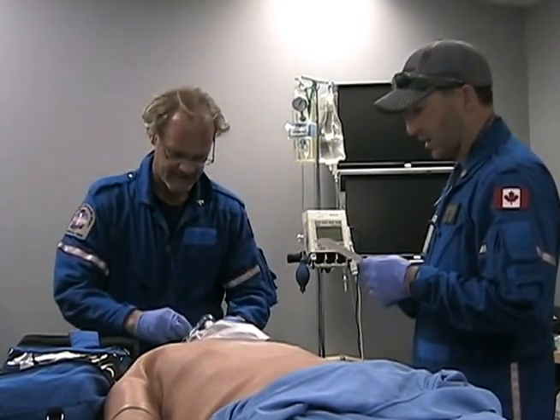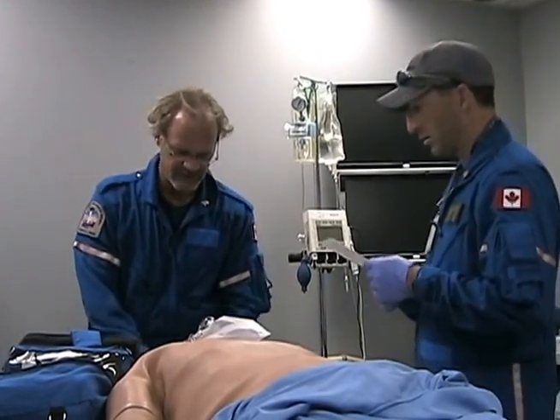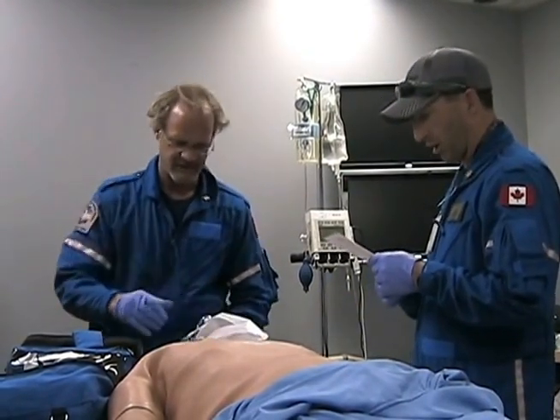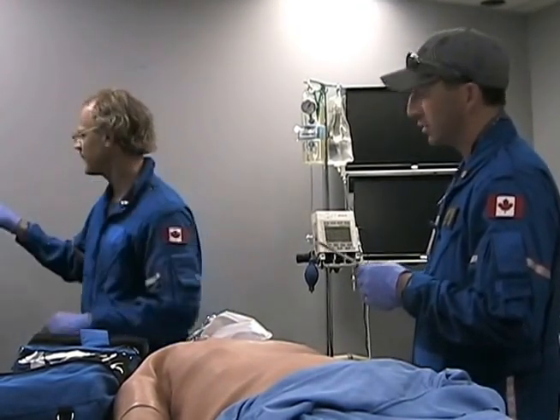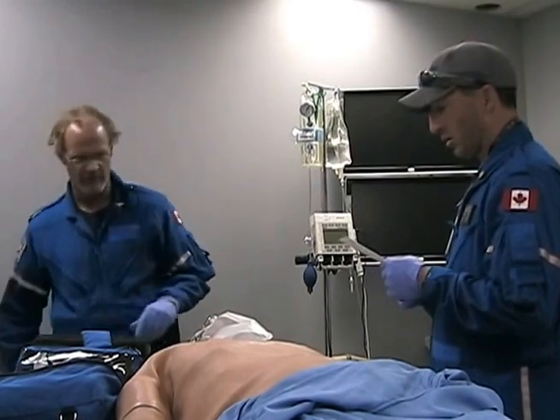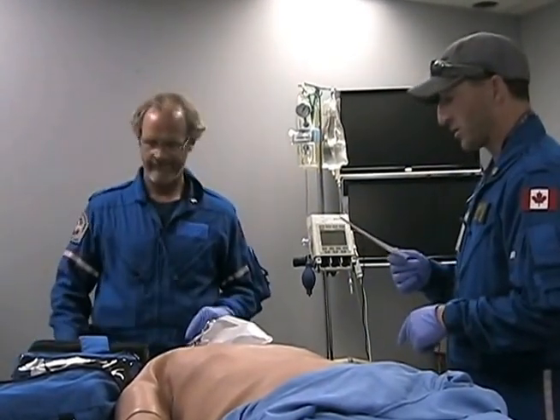Okay, what's next? It says NRB or BVM plus or minus PEEP valve. Okay, his sats are 99, so we don't need the PEEP valve, so we got that NRB on it at 15. Great. O2, two sources on, sufficient amount. Yeah, both are on, and both have a sufficient amount. Monitor on. Can you just turn the monitor on there? Yeah, got it. Great.